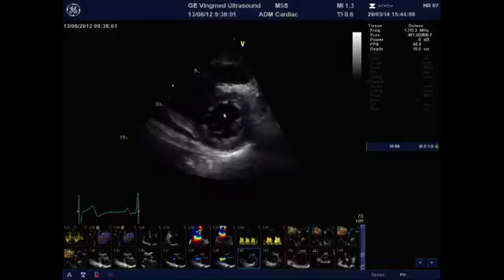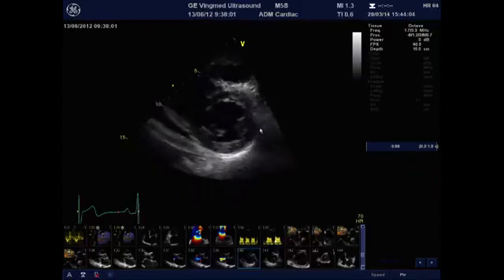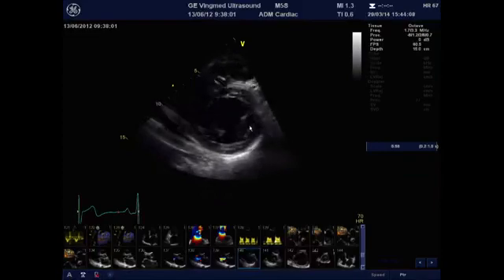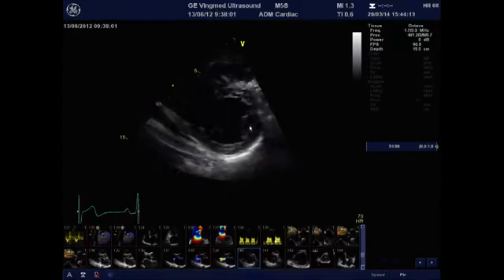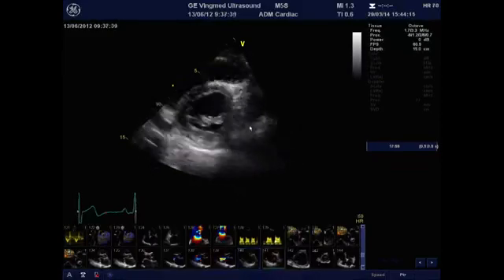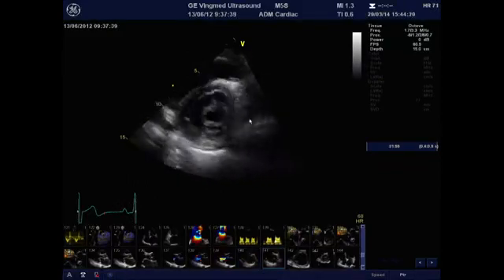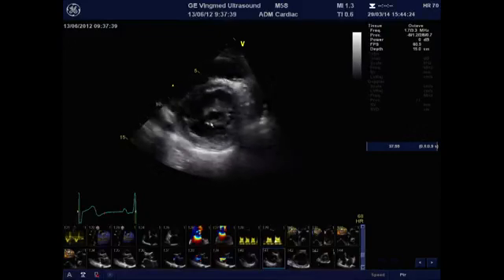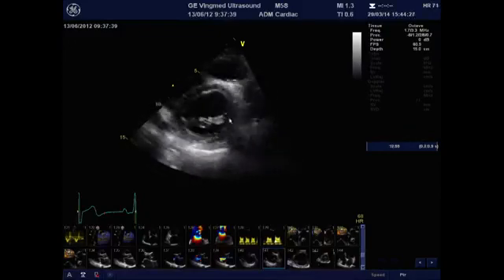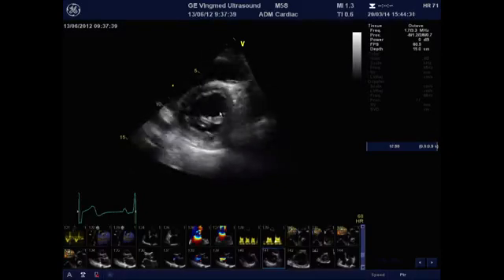parasternal short axis view. And here it's an intermediate view somewhere between the papillary muscles and the leaflet tips, because you will start scanning further to find the morphology of the mitral valve also in the parasternal short axis view. And by going upper, you see here that I'm just moving the probe from the papillary muscle to the level of the mitral valve opening, and I'm seeing here beautifully the mitral valve orifice in diastole, which has a fish mouth appearance.